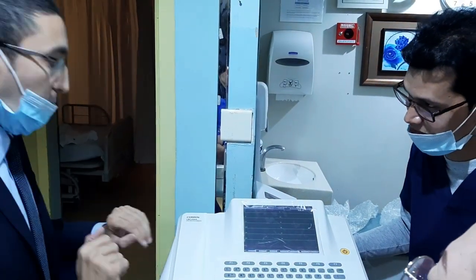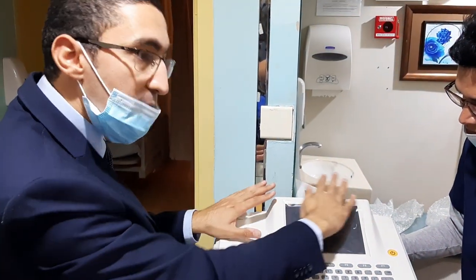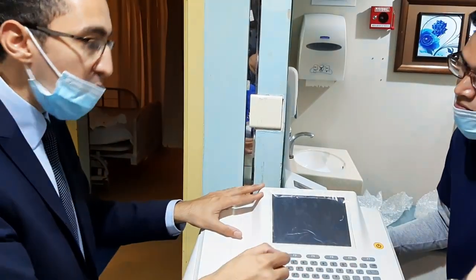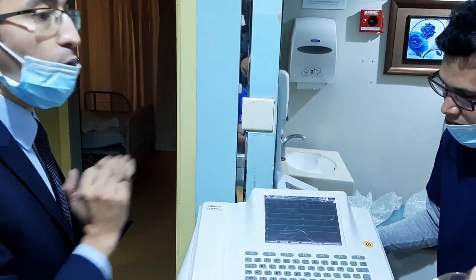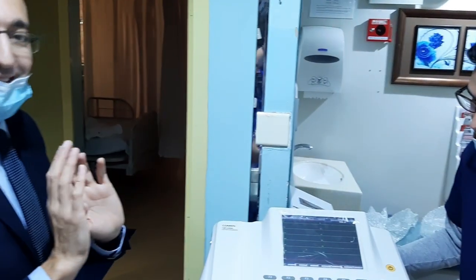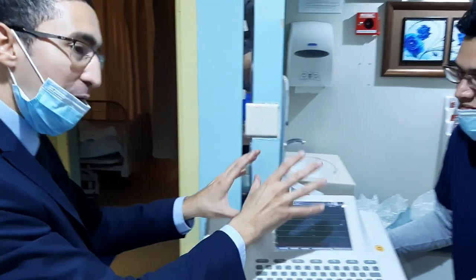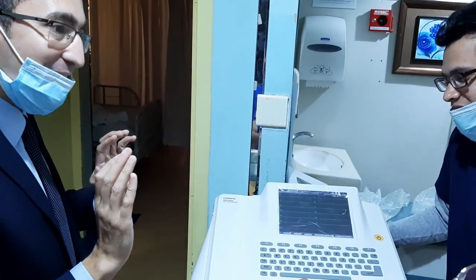Type. This one for sleep, only sleep display. Between patient and patient, no need to turn off the machine, just sleep for display, then press back, it will work. This one sleep is only for the display. Sleep only turns off the display, not the software, nothing, that's it.